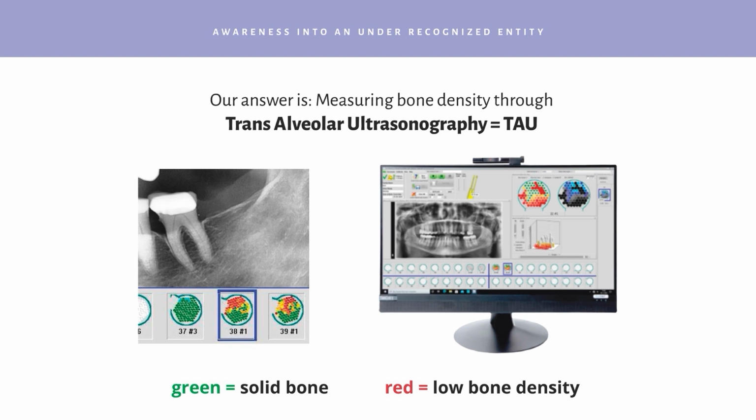On the left, you see a wonderful X-ray, and you see a wonderful edentulous area in a left lower jawbone, and you can't identify any suspicious processes inside the jawbone.